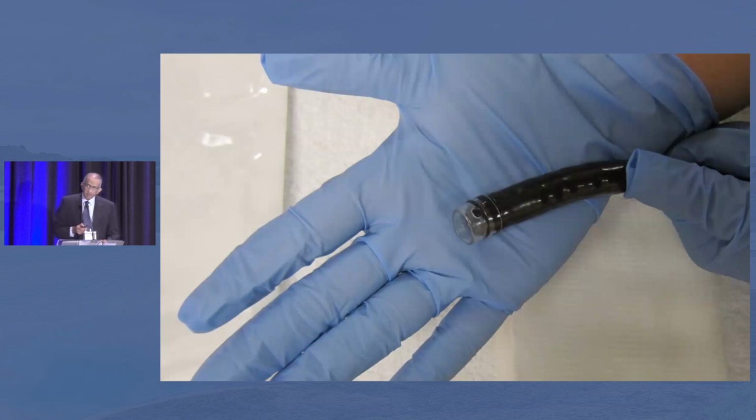It is also important to put a cap, and when you put a cap, the side hole should be away from your suction channel, so that depending upon where the lesion is, the side hole will drain the fluid so that you can have a clear view.